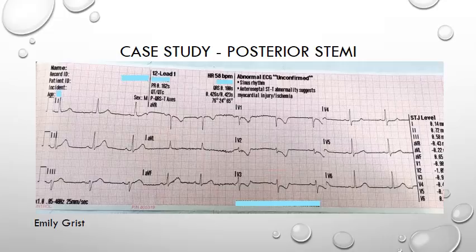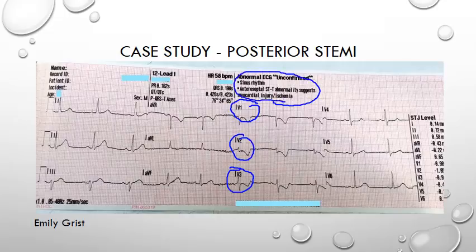In our first ECG submitted by Emily, we can see ST depression in leads V1, V2 and V3, so straight away we're going to be considering a posterior STEMI as the cause. The computer reads this as an abnormal ECG with ST depression suggestive of myocardial injury or ischemia. For us though, we're concerned this could be a posterior infarction, and the treatment would be very different, so let's go ahead and place our electrodes posteriorly and record V7 and V8.